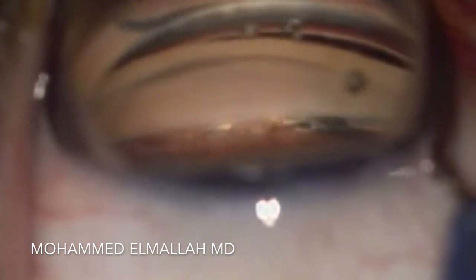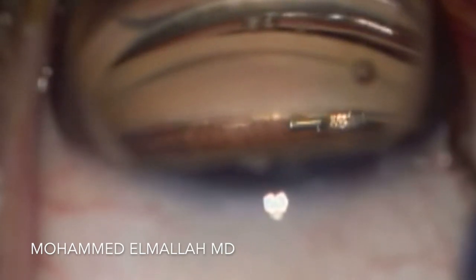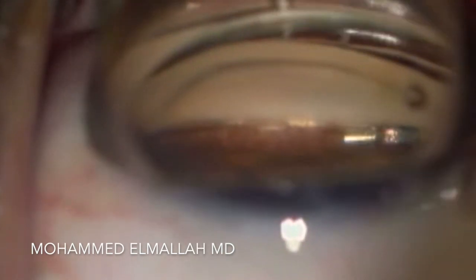As the Hydrus stent goes in, you will notice three windows — the first one, the second one, and then the third one. You'll want to see all three in Schlemm's canal, parallel to the iris plane.